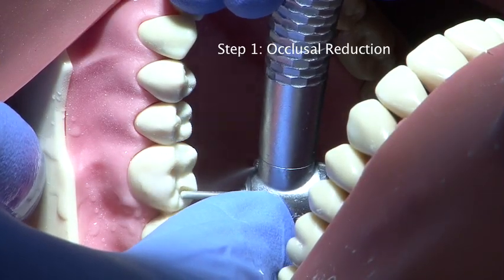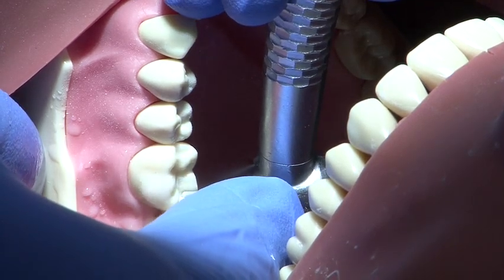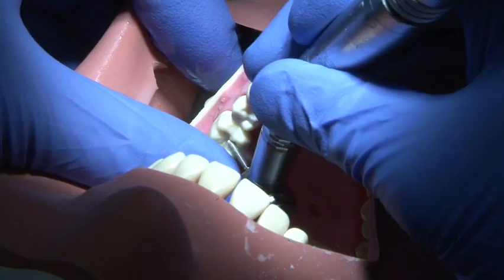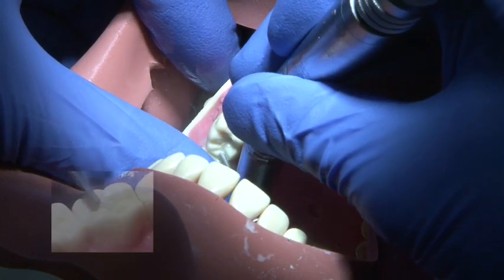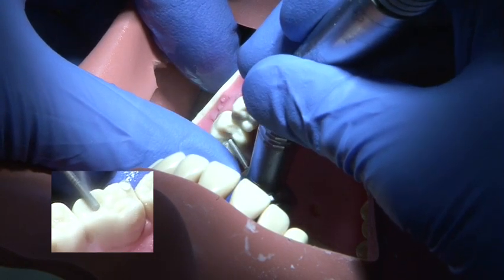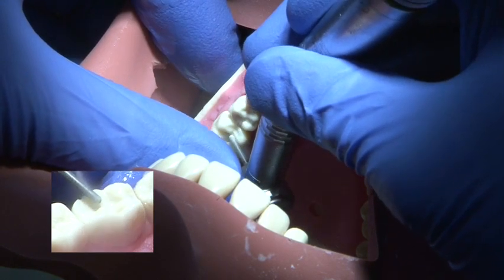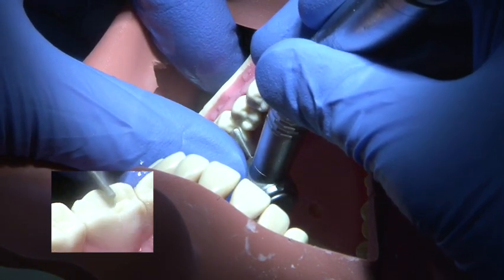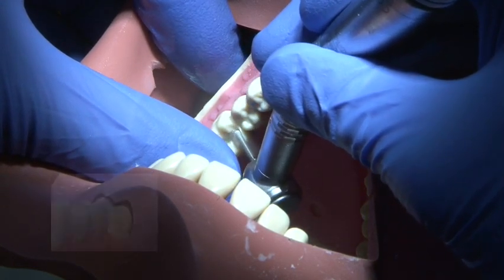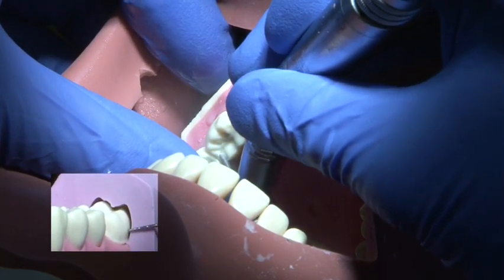The occlusal surface is reduced to a depth of one millimetre using a parallel sided medium grit round ended bur. The natural outline of the cusp slopes must be followed to maintain resistance form. Occlusal reduction is then checked using a putty matrix to ensure adequate reduction.